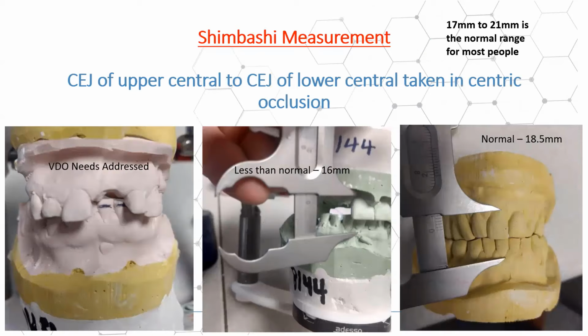Okay, the other measurements. This is a Shimbashi here that you see, and if you follow my mouse, on the right, this is normal. We have an 18.5 millimeter measurement from the CEJ of the lower to the CEJ of the upper. The middle is less than normal, it's 16, and that's a borderline measurement. The way we determine whether we should use that is we look at the photographs of the patient smiling and some of their facial features, and we determine that this is fine, tooth display is good. We would continue on with this measurement, or suggest an opening that allows the patient's facial features to look better, meaning they have this collapsed look to their face, they have crow lines coming from the commissures or corners of their mouth, and a frown on their face from the smile.